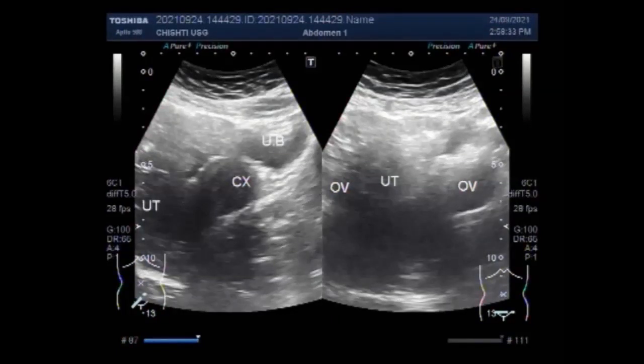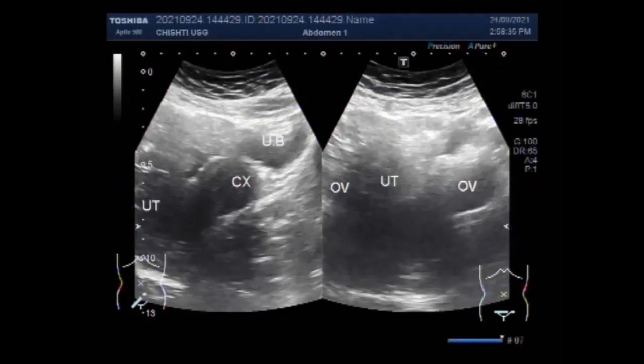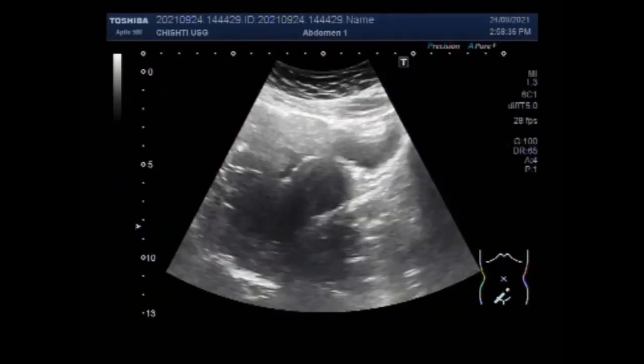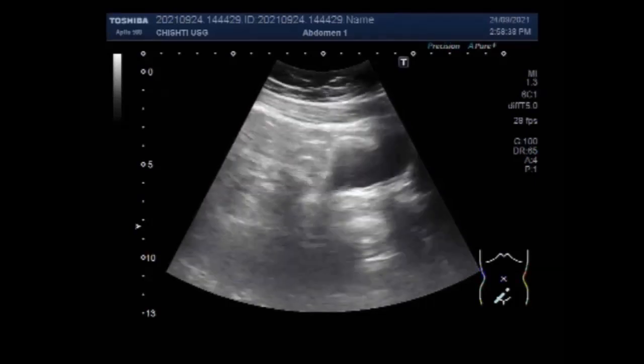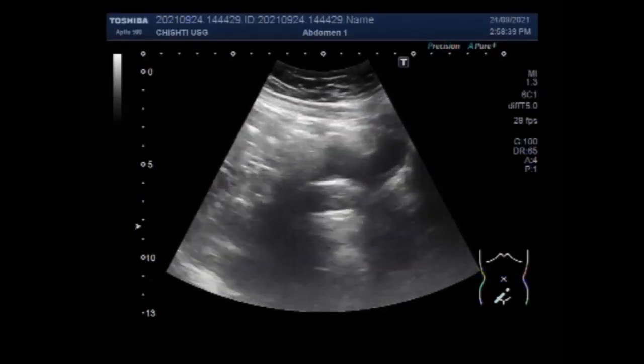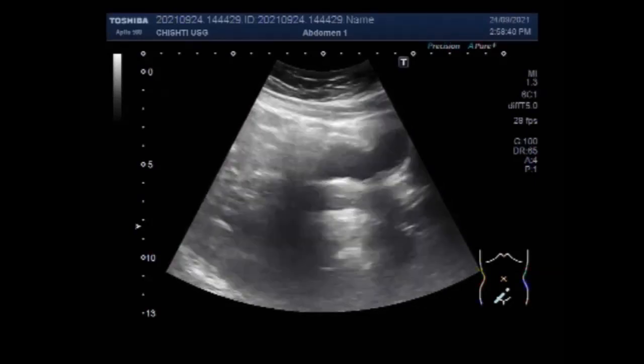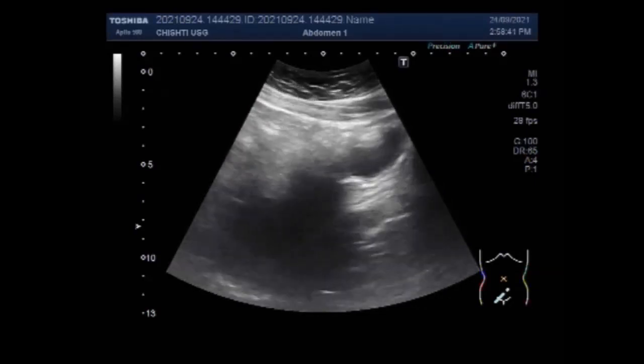Dear viewers, I hope you are all fine. This ultrasound video shows two cases of pelvic inflammatory disease PID with cervicitis.